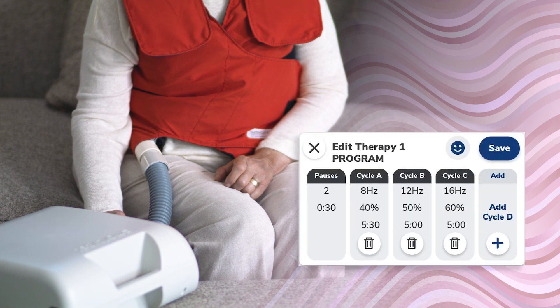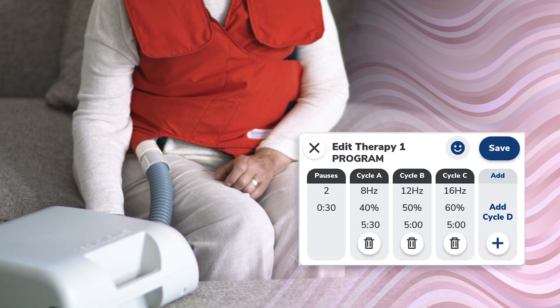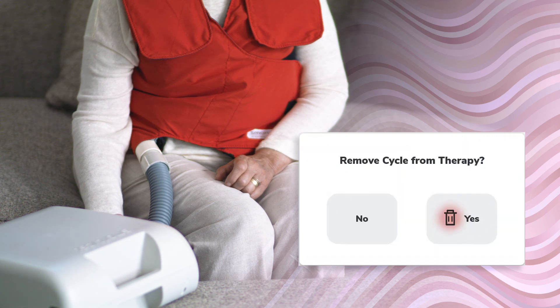From the edit therapy screen for program therapies, cycles can be added by tapping the plus button under add cycle. Cycles can be deleted by tapping the trash can under the cycle to be removed.